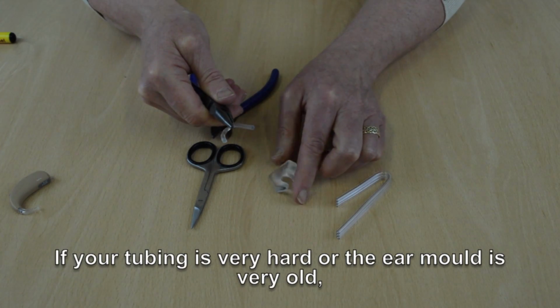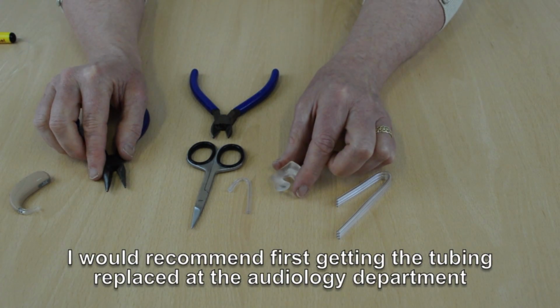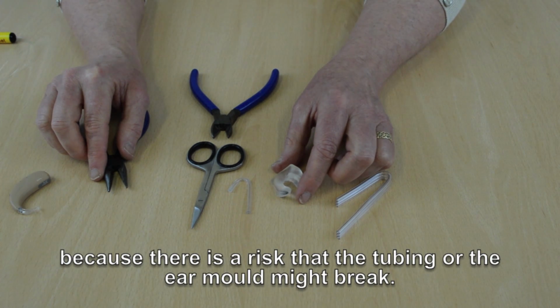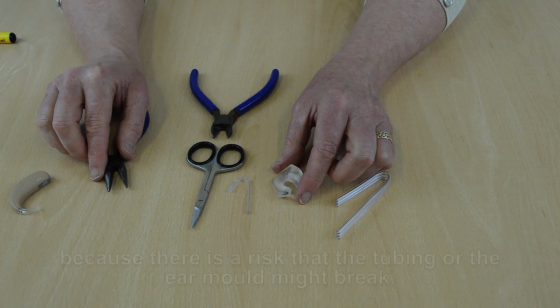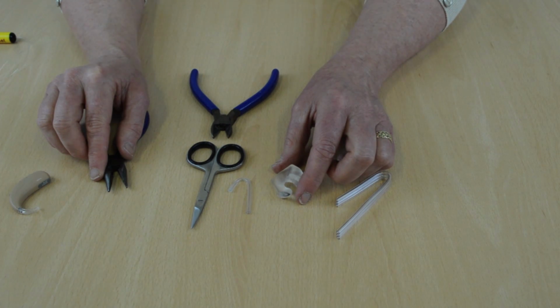Now, if your tubing is very hard or your ear mould is very old, I would recommend first getting the tubing replaced at the audiology department, because there is a risk that the tubing or the ear mould might break while you're trying to do this. It's best to do this process only if your tubing has been changed within the last 6 to 9 months.